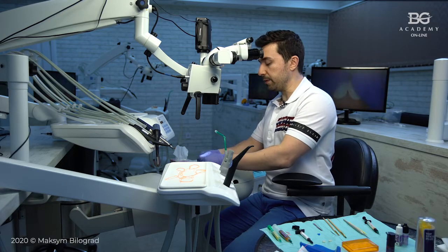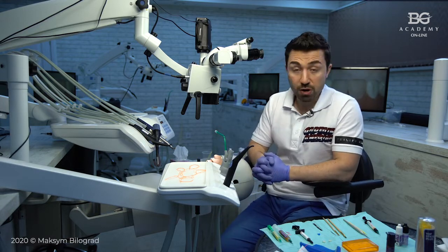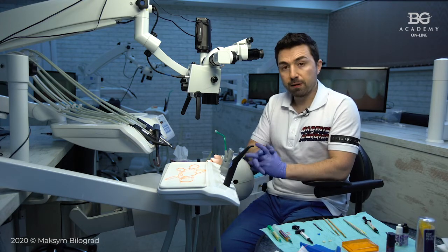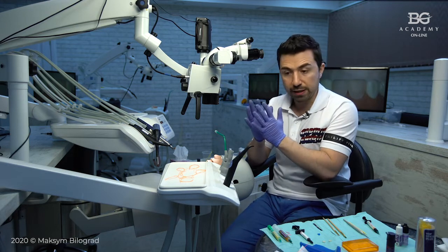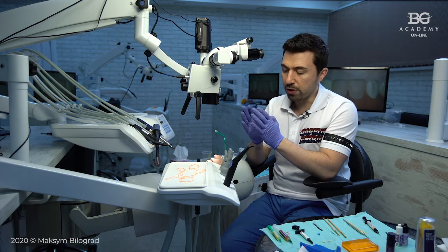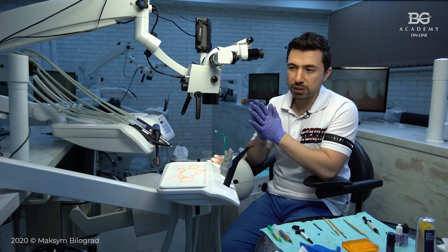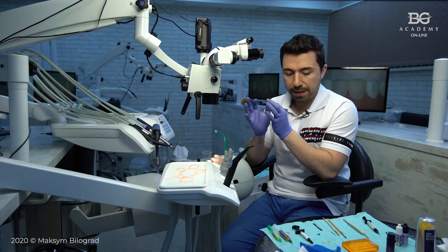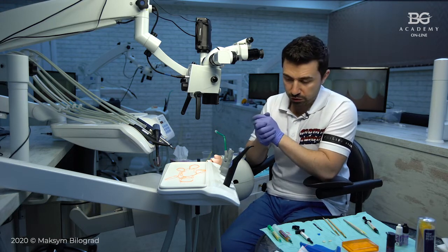Regarding try-in, you can use try-in pastes from your resin cement system. But if the veneer that is made in the lab has a perfect surface fit, that means your dental technician used a really thin layer of spacer. A thin layer of spacer means less than 50 microns. That means the color of the cement will not influence the final color of the restoration.